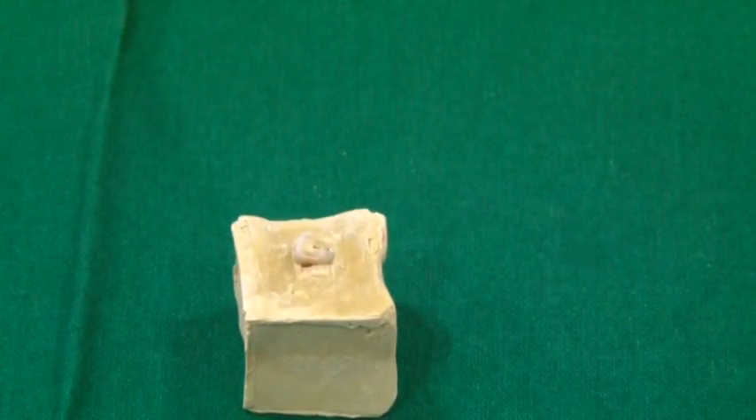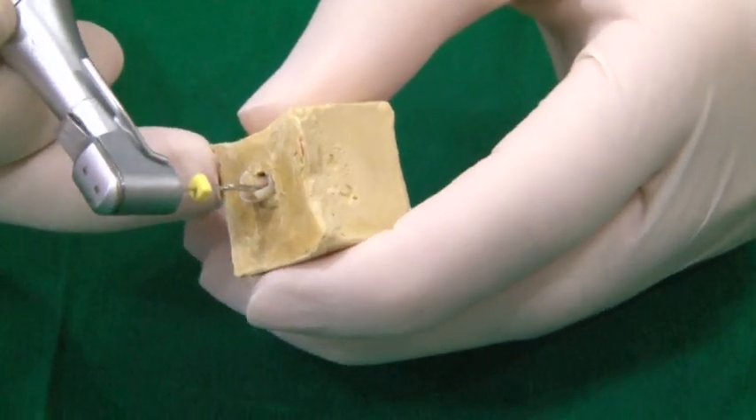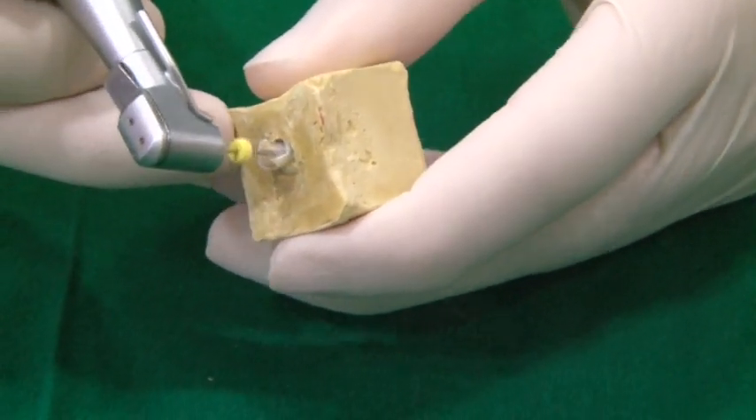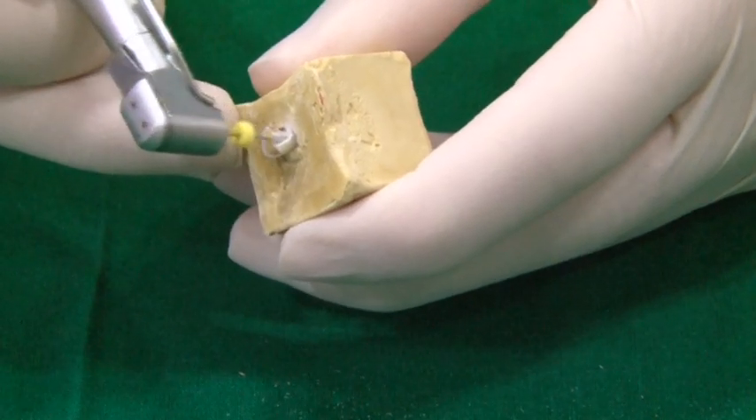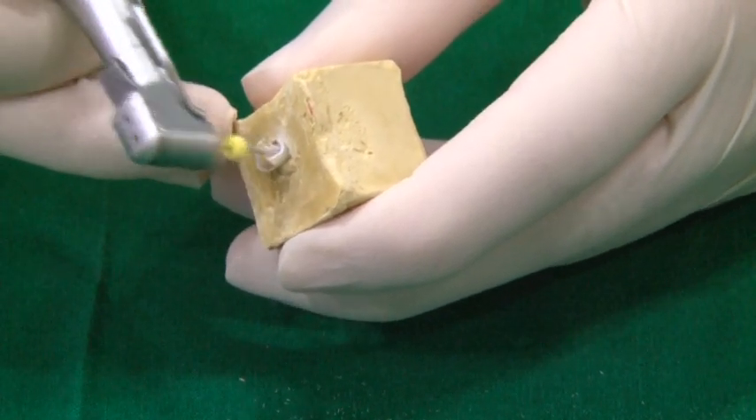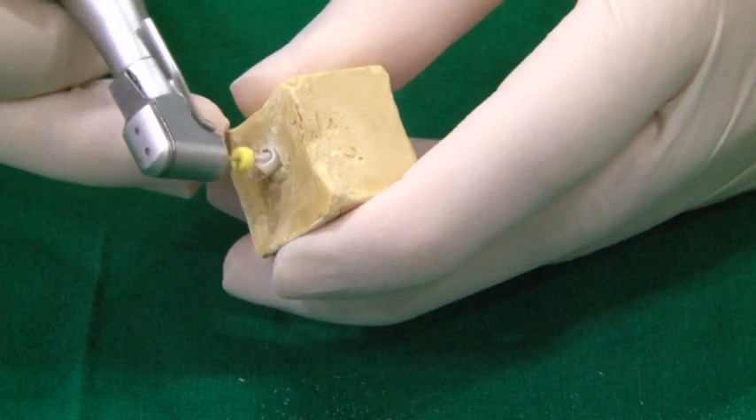Only remove part of the GP with this instrument. Using successive sizes of the Peeso reamer, enlarge the canal one or two sizes to match the size with the configuration of the post. If required, take a radiograph to verify the post space.